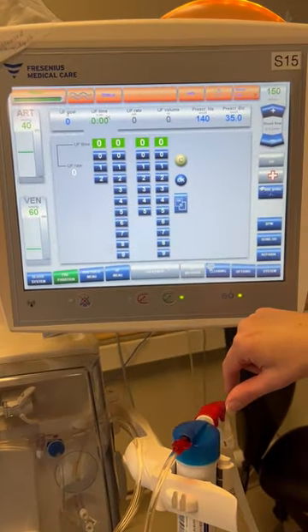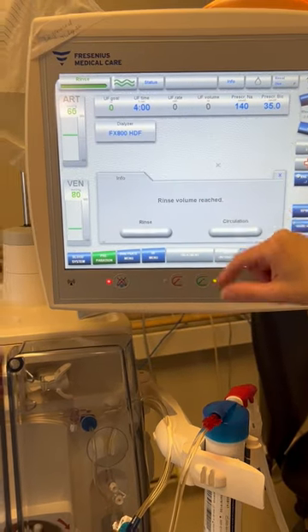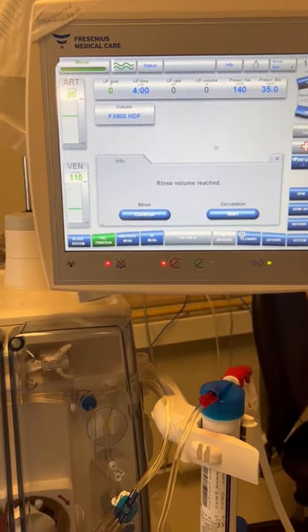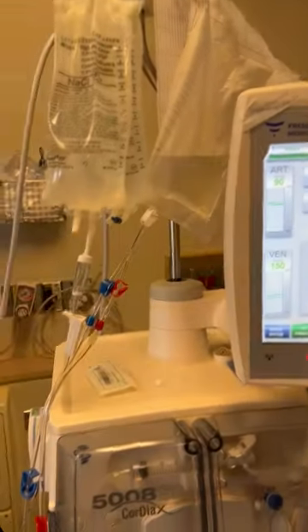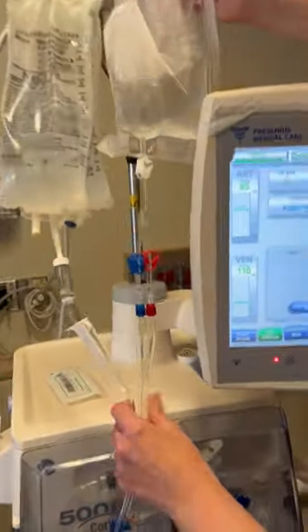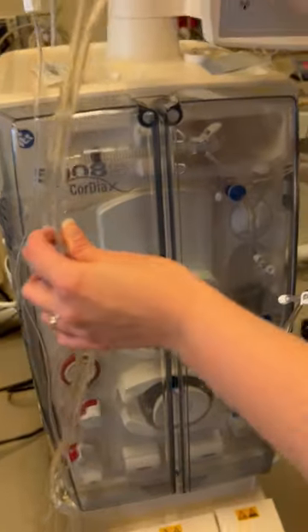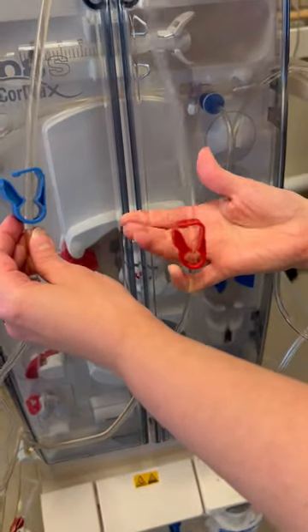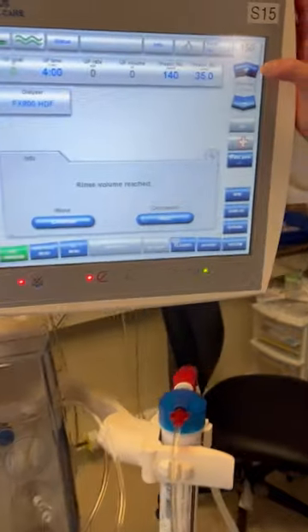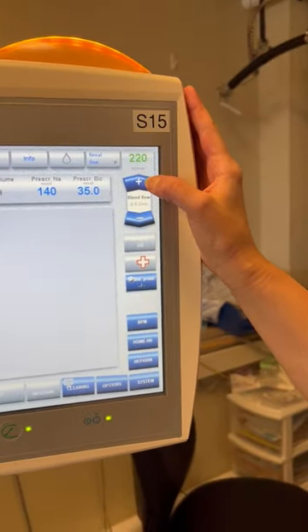We can go ahead and start programming our treatment parameters. We're going to program in a four-hour treatment. Our rinse volume has now reached 500 mils. Before we continue, we're going to want to check our priming bag to ensure that there's fluid in the bag. If there isn't, we might want to look for any leaks and then continue with rinse. We're going to clamp the little white clamp on the priming bag, unclamp the large arterial clamp, click start under the circulation heading, and increase our pump speed to 400 mils per minute.